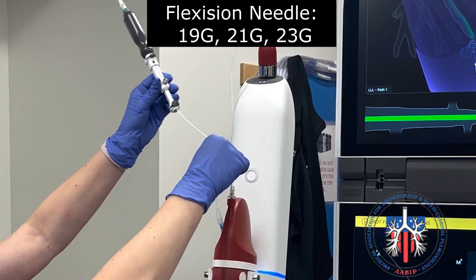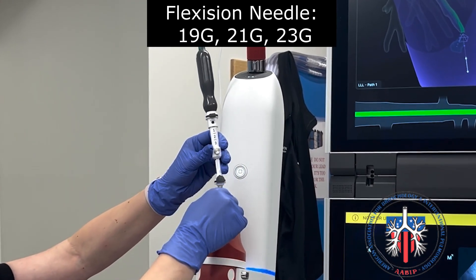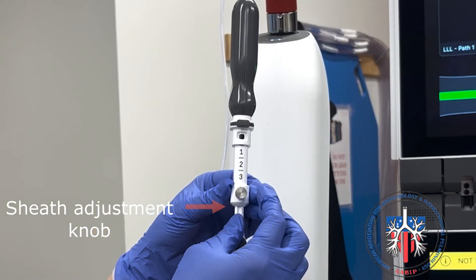When using an ION biopsy needle, make sure to adjust the sheath tip just outside of the robotic catheter.